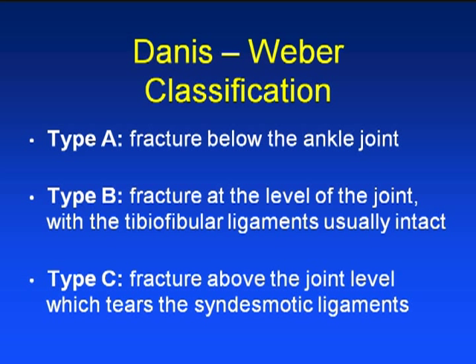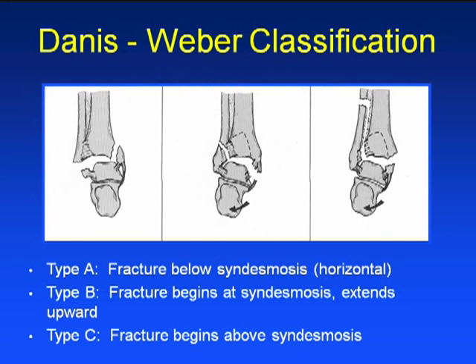And here is an example of each of those. A type A fracture is the distal fibular tip fracture. You guys are familiar with them as just the lower ones. You can have either a comminuted or an obliquely oriented fracture that begins at the level of the plafond. That's an interesting word because the orthopods like to use it, and it actually means the roof formed by the floor of something else. So you come down and the bottom of the tibia ends up being the roof of the mortise, and that's called the plafond.